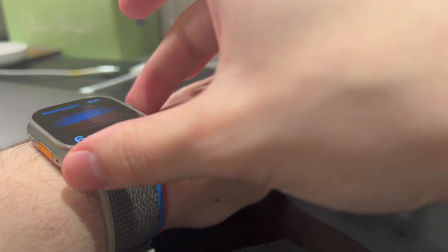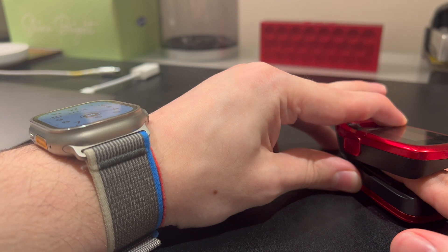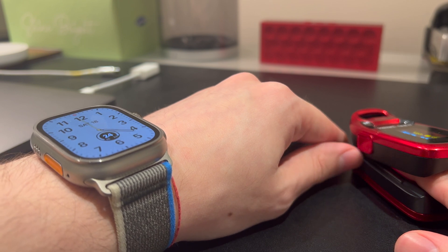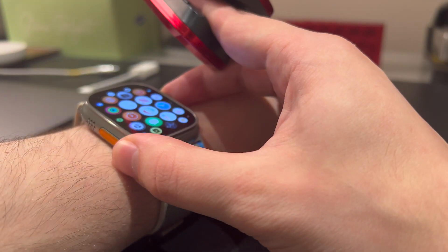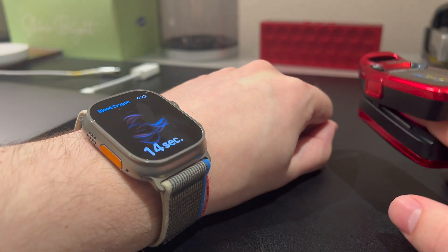Let's do another one, just for our own sanity — third time, why not? Like I said, not a scientific test by any stretch of the imagination, it's just a subjective test. I think if the conditions are right, you definitely can get an accurate reading, but obviously it's not going to be as reliable as a medical-grade device — but it's still pretty accurate when you get the conditions right.